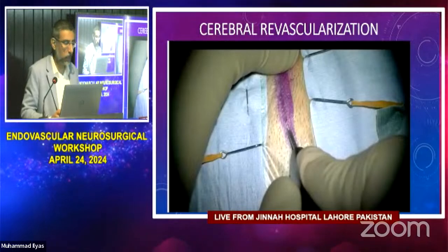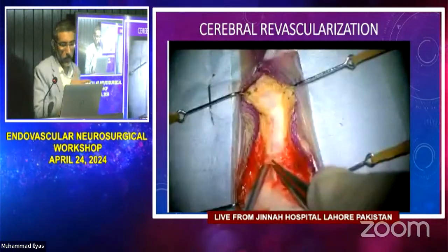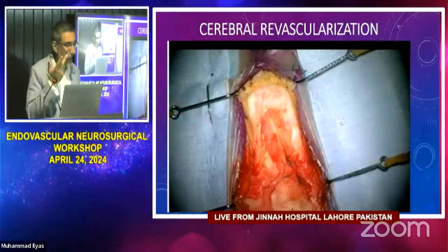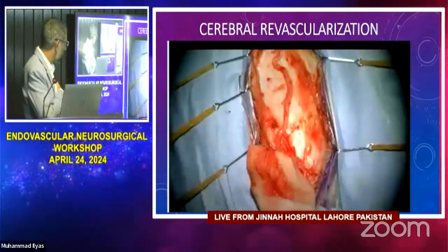Do we have time? Can I just show a short video? Okay. I think this one is important since, as Dr. said, we don't do it. Under the microscope or under loupes, you just find that STA. You can see the STA right there, thumping right there.